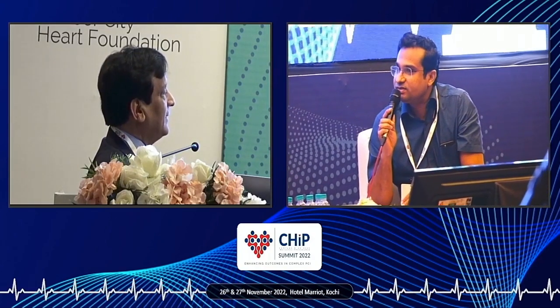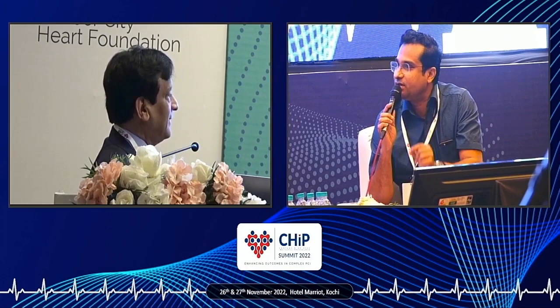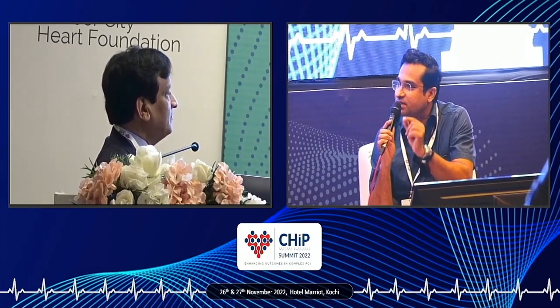Recently, we had a case where the patient developed severe bradycardia with transient CHB during LAD rotablation. So, are there any specific points where we should anticipate a temporary pacemaker in LAD rotablation? Yeah, very good point. We have published that you have it in left main and ostial LAD. Was that an ostial LAD case? No, sir, it's proximal LAD. Okay. We have seen the same asystole in left main and ostial LADs. Usually proximal LAD does not, but sometimes it could happen.